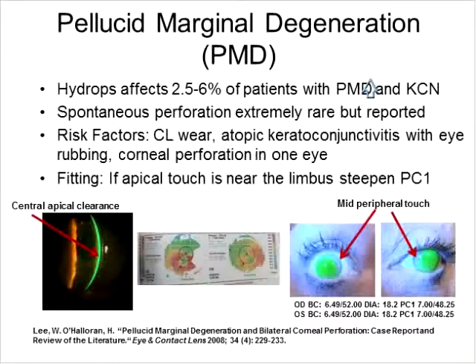All right, thank you very much. And Jill Bryan asks, what companies offer a quadrant-specific option for scleral lenses? Actually, we have an answer from Afe, and he says Trueform does. Trueform has quadricone and I think some other options for quadrant-specific curves. Anybody else?